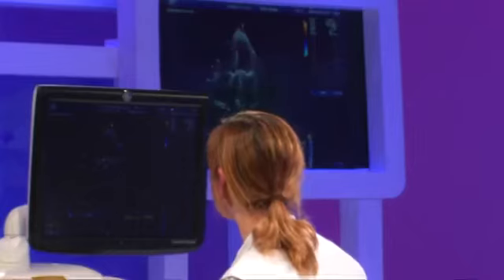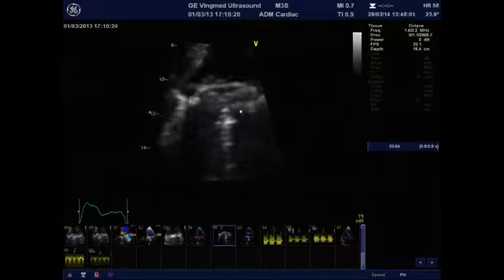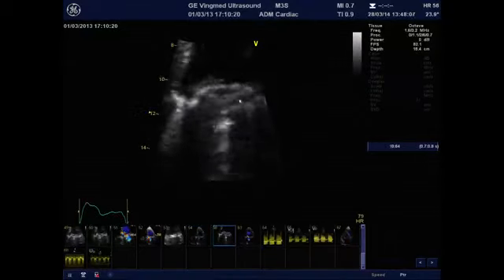This is a patient with a mechanical prosthesis in the mitral position. He presented in the emergency room with symptoms of abrupt heart failure. As you can see here, it's really easy to see that the movement of the mechanical disc is not normal. When you use zoom mode, you can see that one disc is moving, but the other one over here is completely fixed. And moreover, you can see that strange structure over here that can correspond to a thrombus or a vegetation.